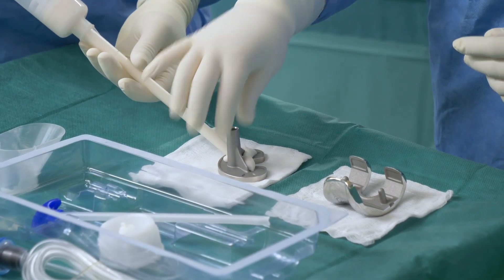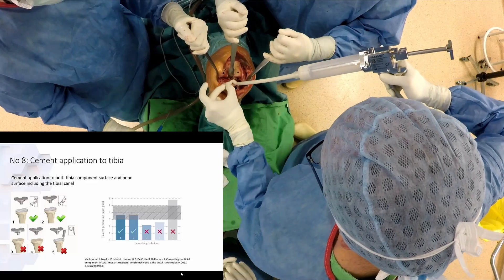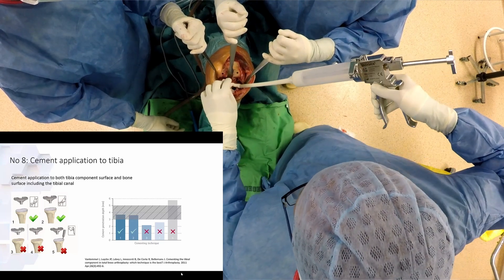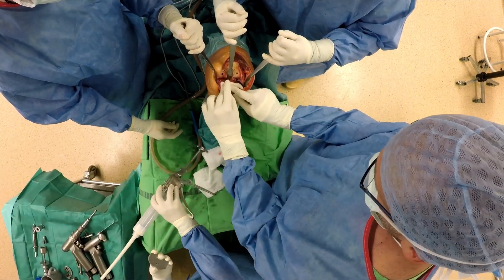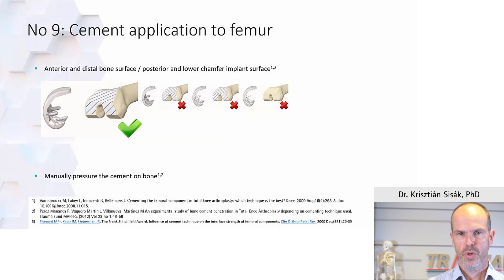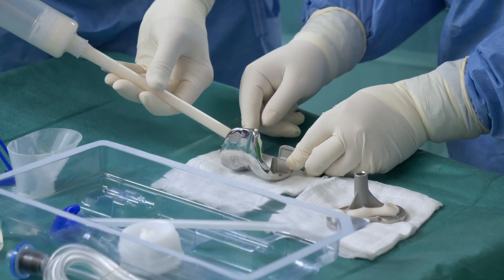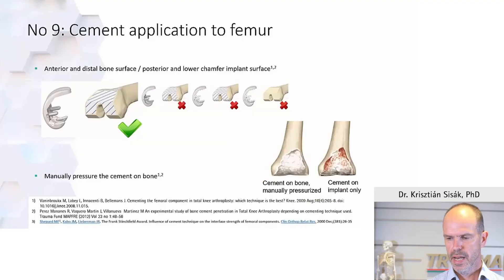It is extremely important to apply cement both to the implant and the bone, for both the tibia and the femur. Put cement on the tibial surface you have created and cleaned, and manually pressurize it — this allows the best penetration into the tibial metaphyseal area. The same applies to the femur. Crucial areas include the anterior and posterior flange, where you sometimes see lytic areas on postoperative X-rays. You must put bone cement on both the implants and the bone, particularly the anterior flange and posterior condyles.